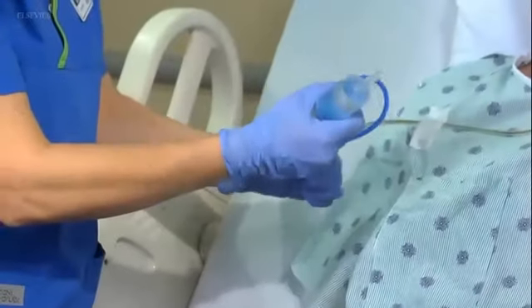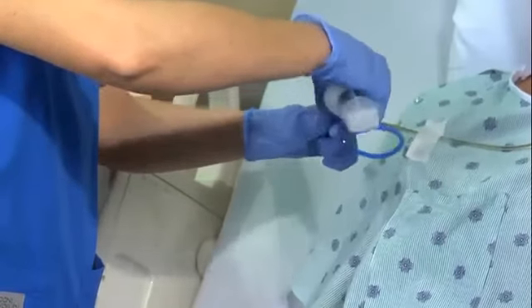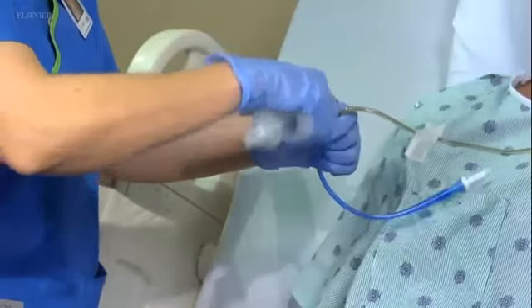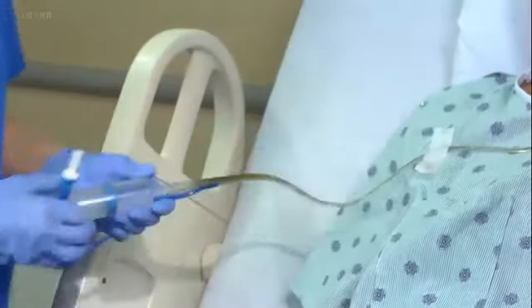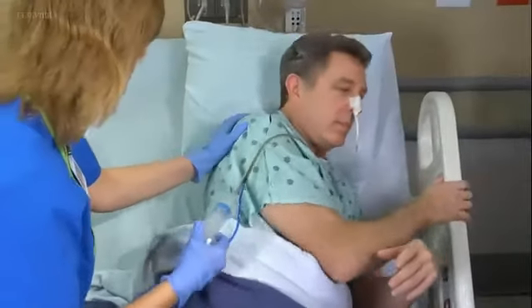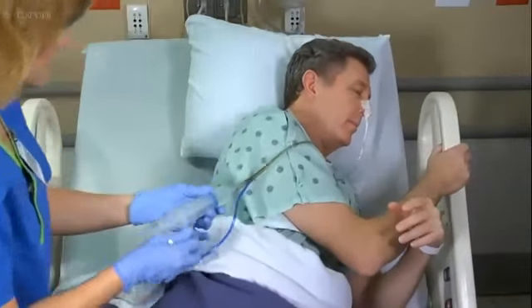Kink the NG tube when you disconnect it from the administration tubing or when you remove the plug at the end of the tube. Insert the tip of the syringe into the end of the feeding tube. Release the kink and slowly instill the irrigation solution. If you're unable to instill the fluid, reposition the patient onto his left side and try again.